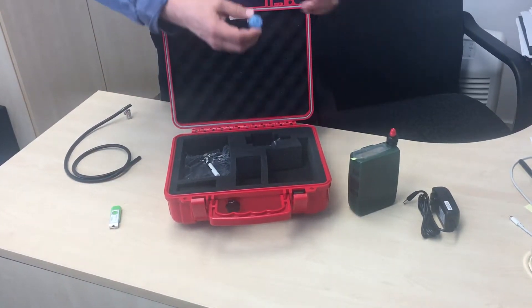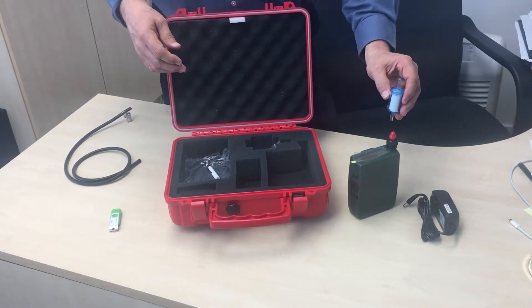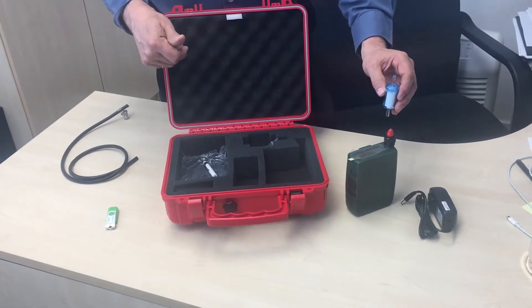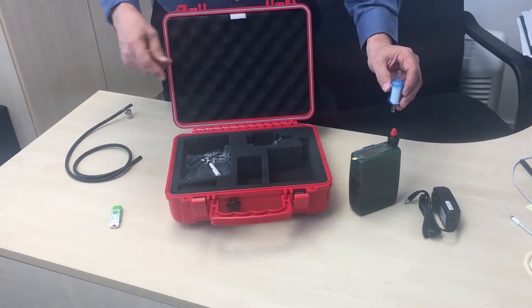Next is a HEPA filter, used if you want to zero out the unit before use. When you put this on the unit and purge it, it will suck all the particles out and the display will read zero.